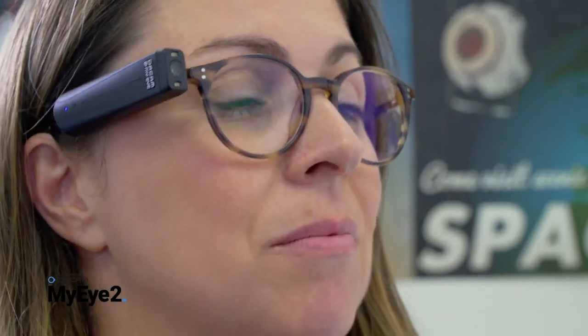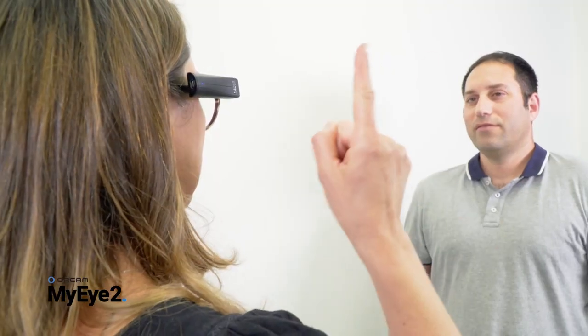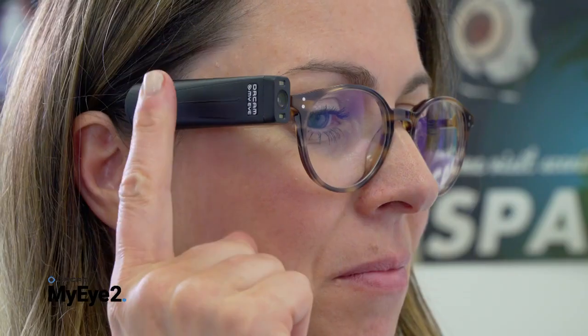Then you will hear, "Please name the person in front of you after the beep." David. You will hear a playback of the recording and options to choose from. "David. Touch to confirm adding person, swipe to record again or double tap to abort."